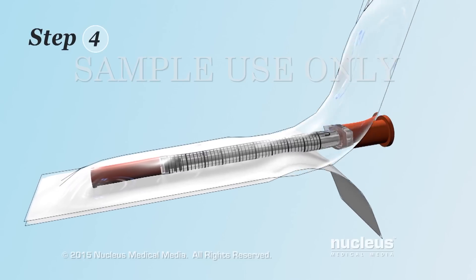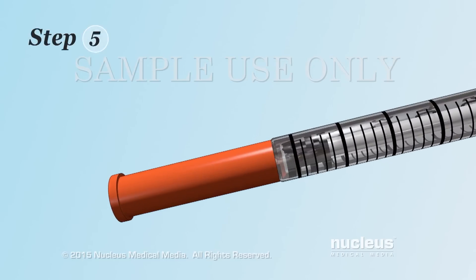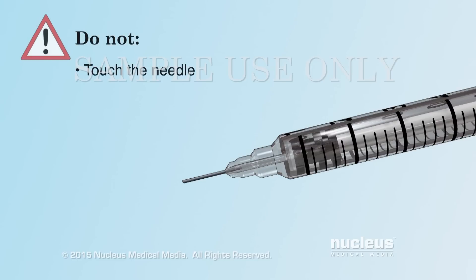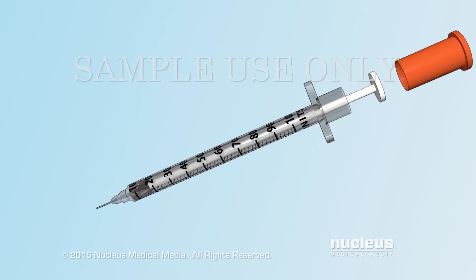Step 4: Remove the syringe from its package. Be sure to use a new syringe each time you inject insulin. Step 5: Remove the needle cap from the syringe. Do not touch the needle or allow it to touch any surface, and do not use the syringe if the needle is bent. Some syringes have a cap over the plunger that you may need to remove as well.